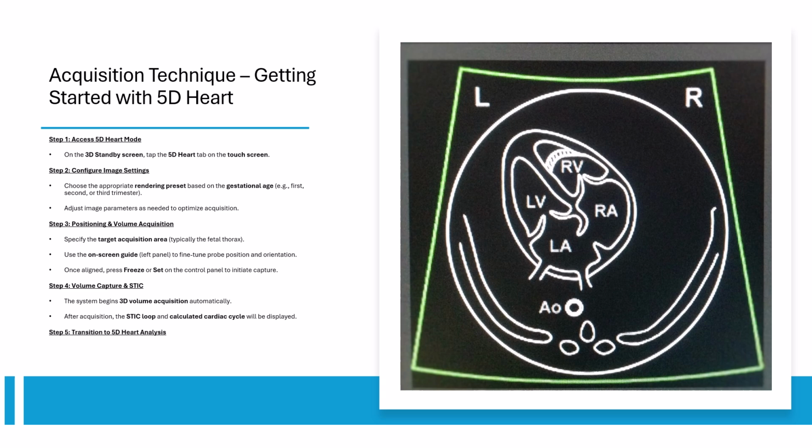After acquisition, the system will display the STIC loop along with the calculated cardiac cycle. At this point, the interface will seamlessly transition to the 5D heart analysis screen, ready for intelligent reconstruction of cardiac views. Following these steps ensures a smooth and standardized acquisition workflow, setting the foundation for precise fetal cardiac evaluation.